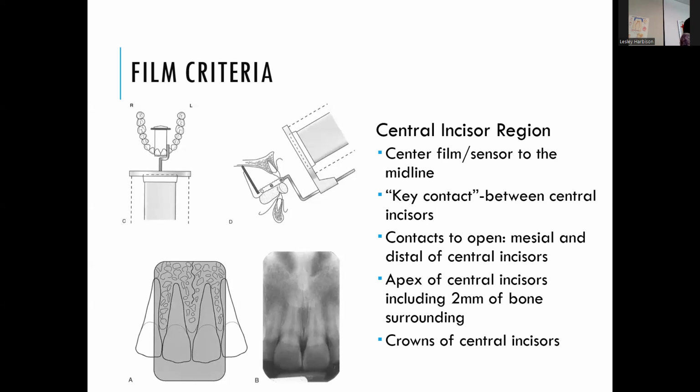A lot of times the doctor still wants an x-ray, because if something's incipient, just barely starting, they really will want to see it on an x-ray. But if you struggle through an FMX and you're running behind and it's just a hair over a third, don't hesitate to say, is this going to be okay? Your instructor might say, no, you've got to retake it. It just depends on the patient and the circumstances.